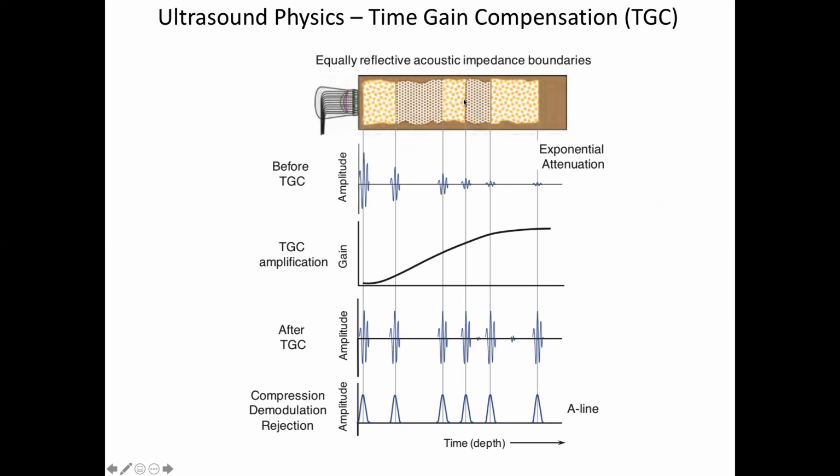When I have a point reflector here, it reflects out basically as a spherical reflection, right? And I'm going to sample a little spot on that spherical reflection. So there's a dramatic drop in the power of the stuff coming back. Think of a little bead at a meter here and I shoot a wave at it. When it reflects back, it comes back as basically a sphere. It doesn't focus that stuff back to me. So when I put out my little receiver, it's receiving a very small amount of that, and that goes as actually the depth squared, right? That term.